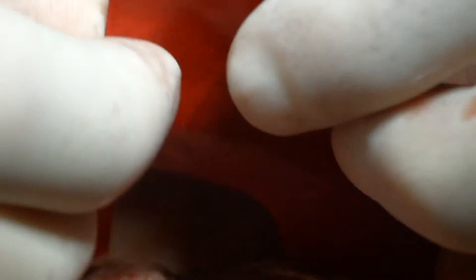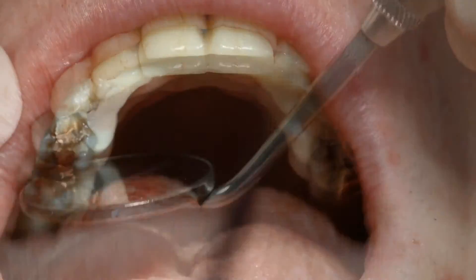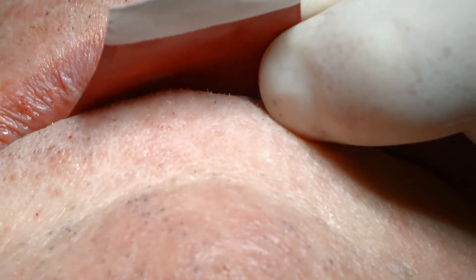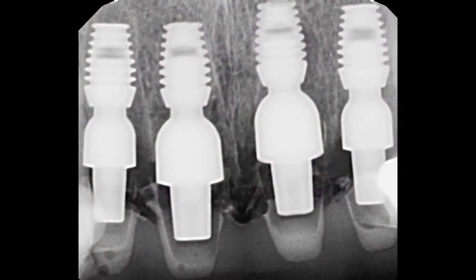The occlusion was confirmed and the stability of the prosthesis was checked after a couple of days and then again after a couple of weeks. After a period of three months, the stabilizing prosthesis was removed and the implants were permanently restored.